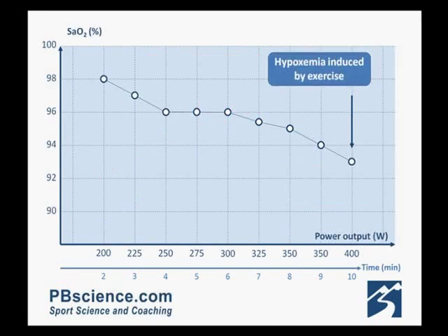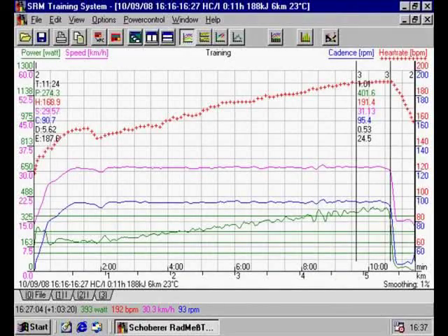The maximum heart rate seen in the test was 191 beats per minute. This athlete did show hypoxemia, with his saturation going down to 93% by the end of the test.